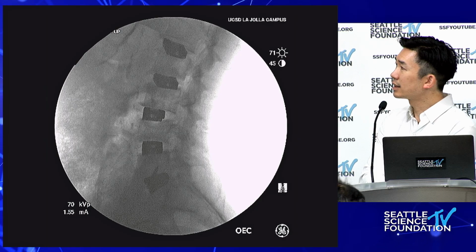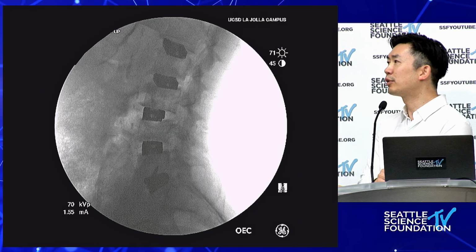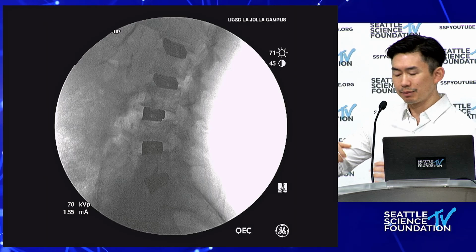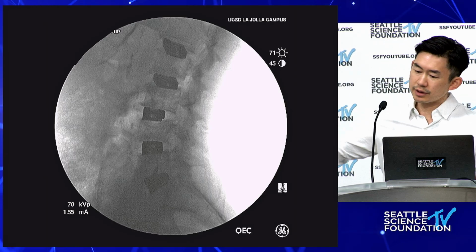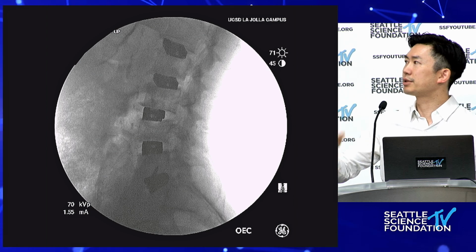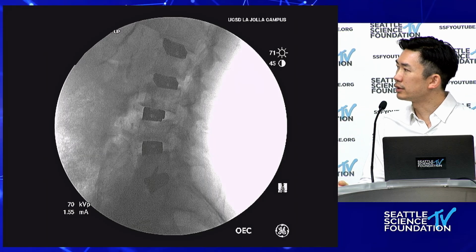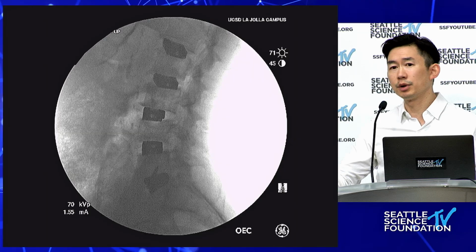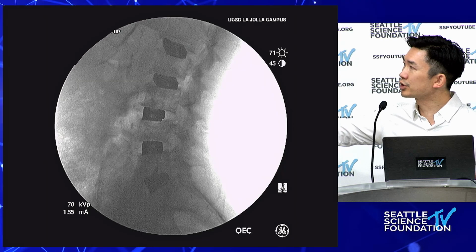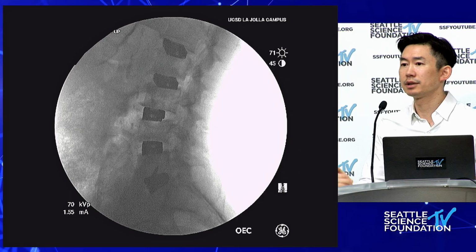And again, for a case like this, it's 5 interbody levels. If I were doing this with fluoroscopy, everyone tries to reduce it, but in my hands, it's always going to be like 5 to 10 shots, right? I take a look at the center. I shoot posteriorly. I swing around to the AP. I mallet it in, shot, mallet it in, shot. It's not perfect. Take another shot. I swing around to a lateral again. It's a shot. And that's at each level, right? It's a lot of fluoroscopy, especially if you're going down the path of MIS deformity or even just a lot of multi-level lateral surgery. And this wasn't perfect, I repositioned and malleted in a few of these, as I showed earlier. The total fluoroscopy for this case, though, was about 10 shots, which is a large reduction in X-ray.